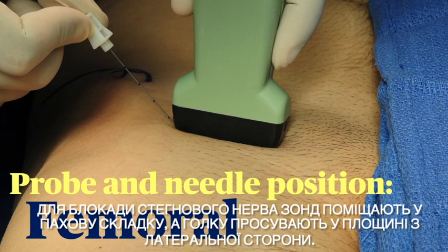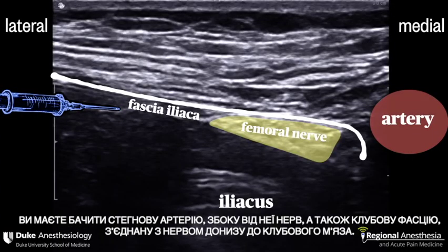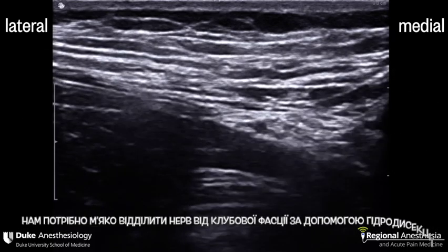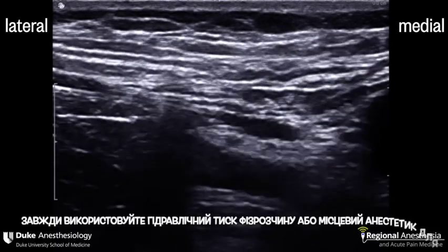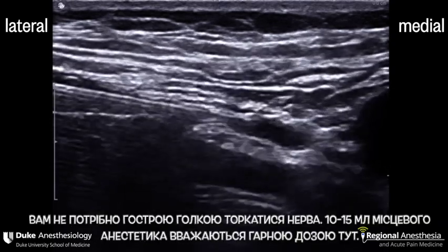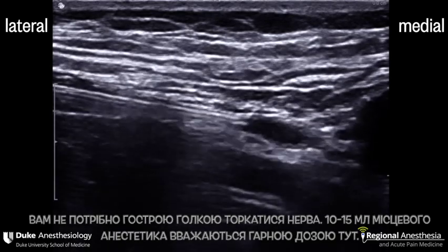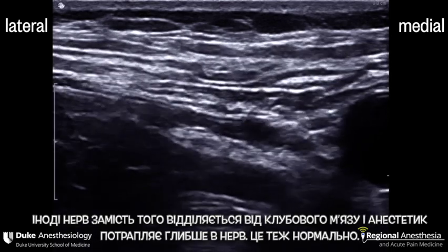For the femoral nerve block, the probe is placed in the inguinal crease and the needle advanced in-plane from the lateral aspect. You should see the femoral artery, the nerve beside it, and the fascia iliaca binding the nerve down to the iliacus muscle. We want to gently hydro-dissect the nerve off the fascia iliaca and look for that unzippering. Always use hydraulic pressure of the saline or local anesthetic to do the mechanical work for you — you don't want sharp needle contact with the nerve. 10-15 ml of local anesthetic is a good dose here. Sometimes the nerve peels off the iliacus muscle instead, and the local is deep to the nerve — that's totally fine too.